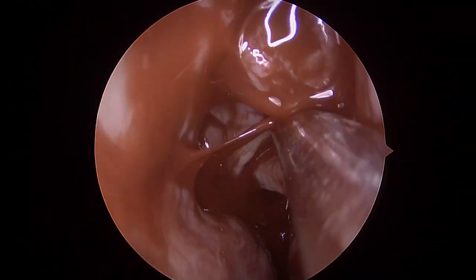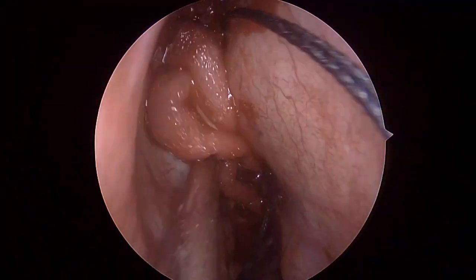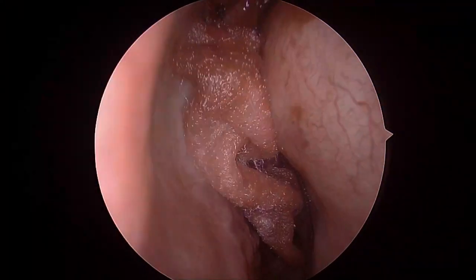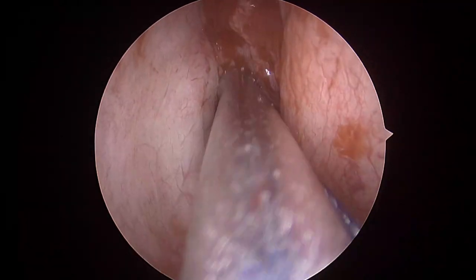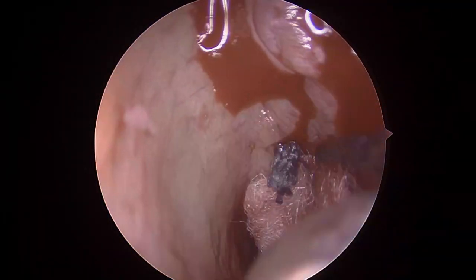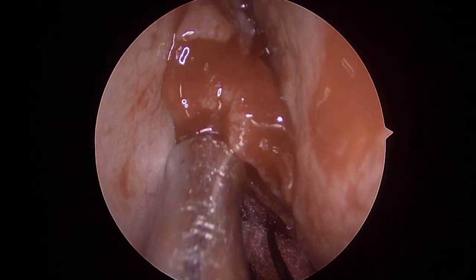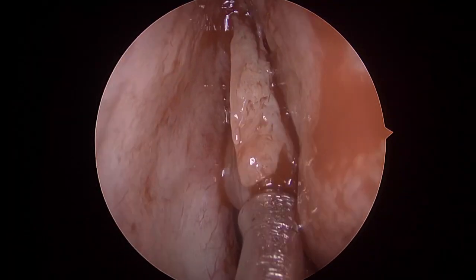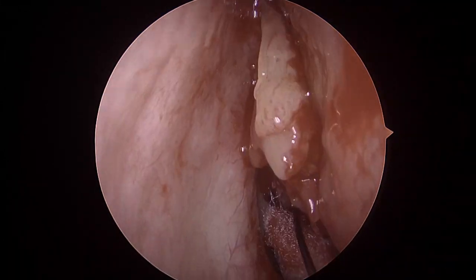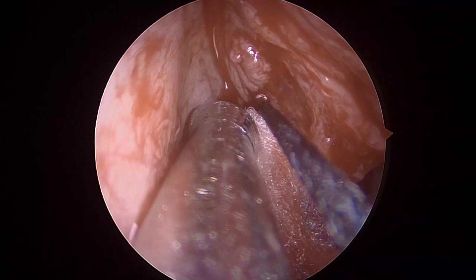So as you can see, we have the bulla in view, we have the uncinate in view. To control a little bit of bleeding, I'm putting a pack in the middle meatus, and now we can get a clear glimpse of the uncinate, the free edge of the uncinate. I also got a glimpse of the axilla superiorly.